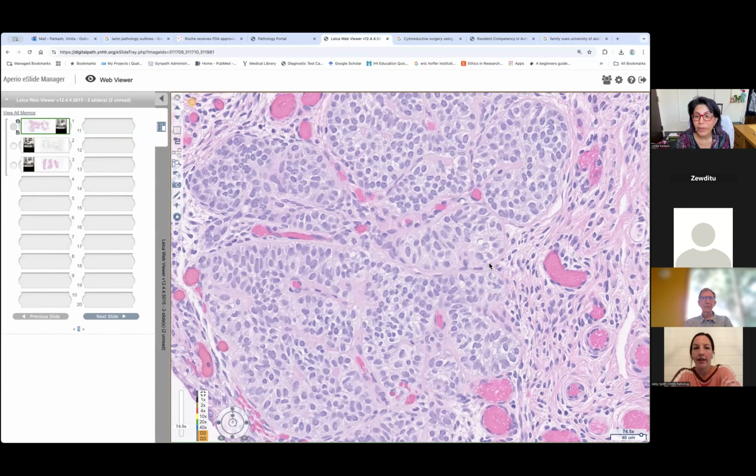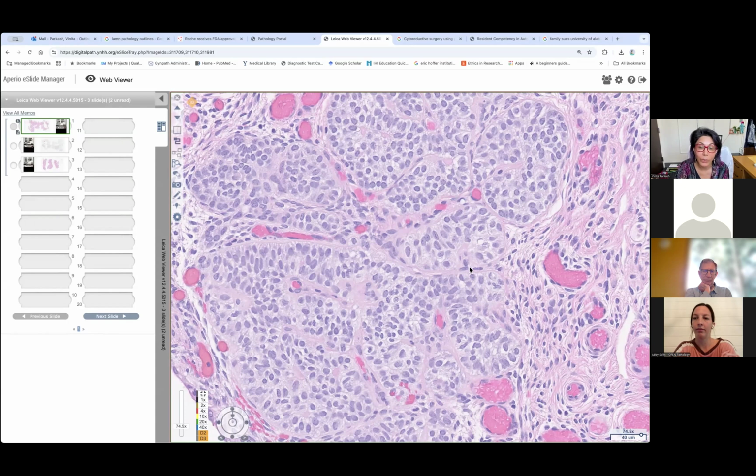So it could be a Brenner cell rest. The distal portion of the fallopian tube where it connects to the peritoneum can undergo transitional metaplasia. And so you can get intrafallopian tube Brenner tumor, whether you'd call a 2 millimeter lesion Brenner tumor or not, I don't know. I probably wouldn't even report it if it was truly just a Brenner-like area. But as I said, it had grooves, and I don't know who said granulosa cells, but I also thought that these were stromal cell differentiation.